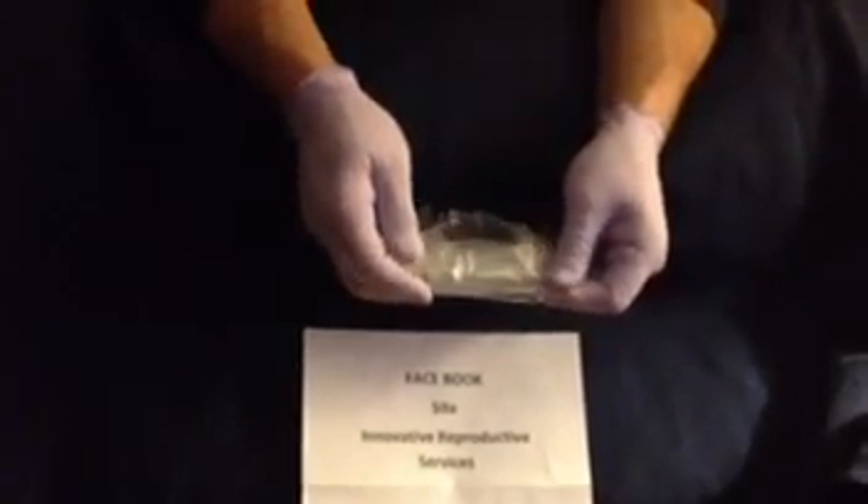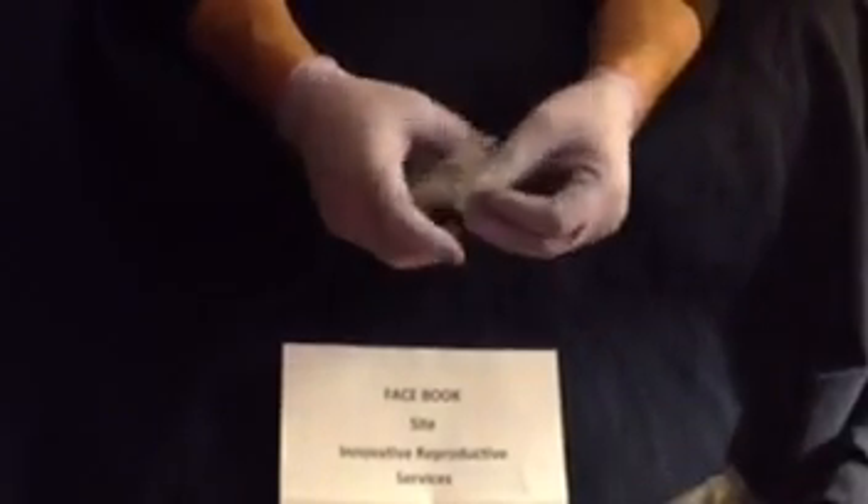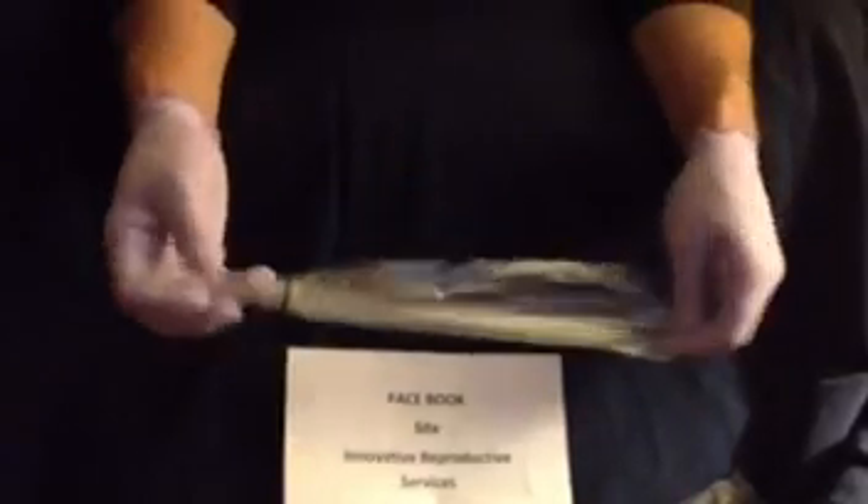This is the second part to our artificial insemination for the dog. This is the collection kit. Our kit consists of a plastic sleeve and a centrifuge tube.